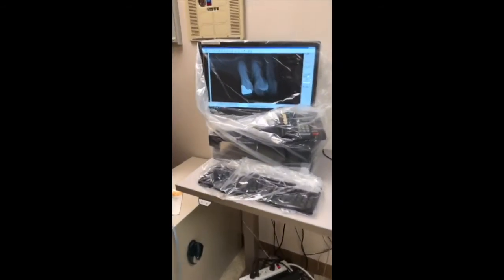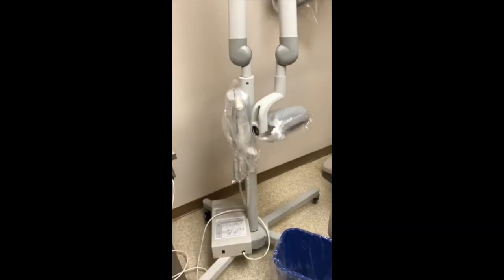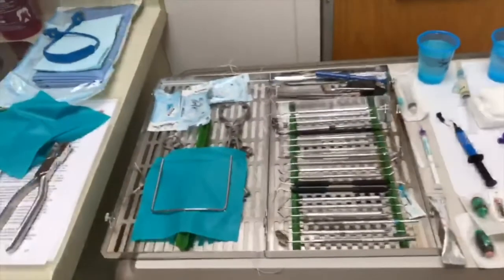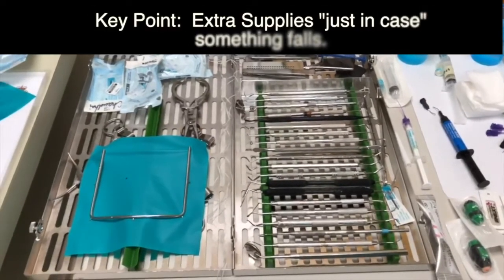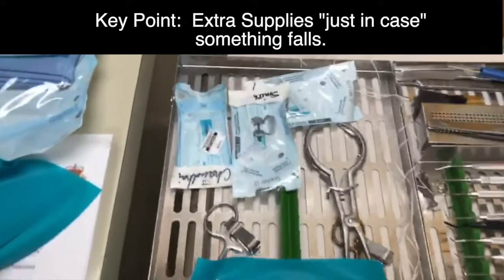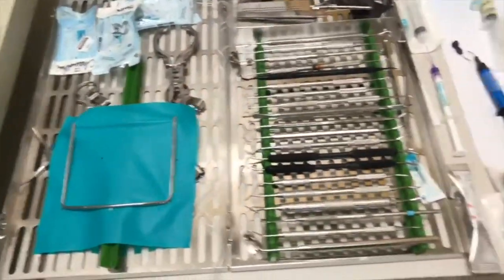Okay, so this is our endo setup. We have the x-ray up for the patient and everything is barriered. We have our portable x-ray unit in the bay and a closed door as well. We have extras on our tray — because if something falls, minimal is usually what we recommend, but you'll see there are some extra instruments. We have extra rubber dam clamps, sterile cotton pellets, and rubber dam ready to go with an extra off to the side.